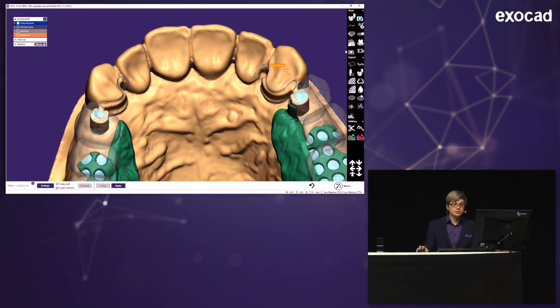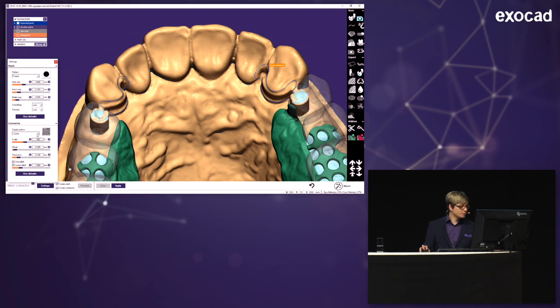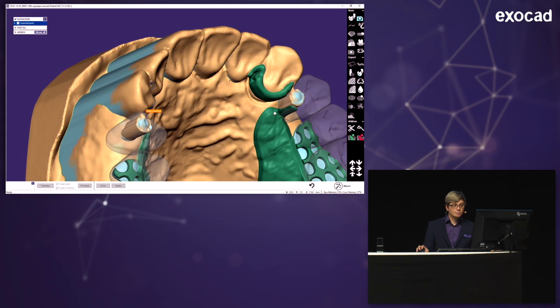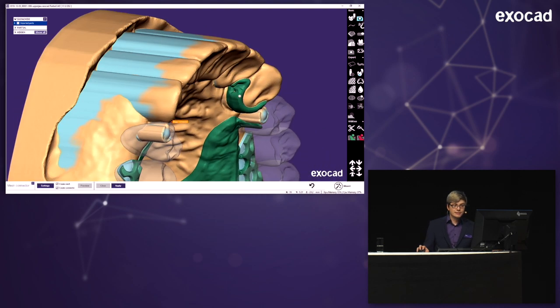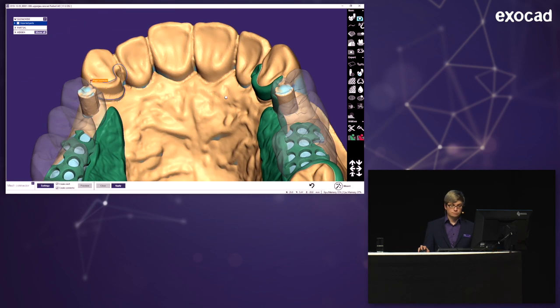But I'm choosing a connector, a major connector. And the first one gets selected as a major connector. And here I can change the settings. And I'm using a stipple pattern, which is smooth, and making it a little bit thinner, like 0.6. And if I apply that, it just gets filled up like this. But since it's a bit complicated and unusual shape for a major connector, to be honest, it gets a little bit rough on some parts. But we can correct that easily later. Now the next curve automatically gets selected. And I'm applying again because I didn't change any settings now.